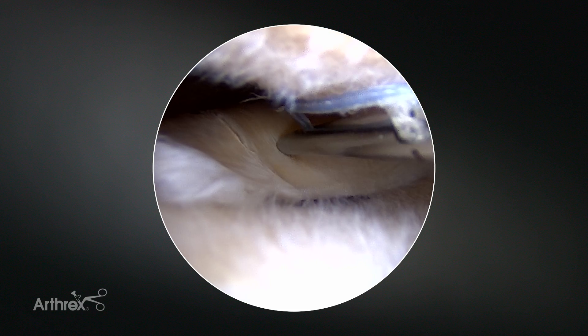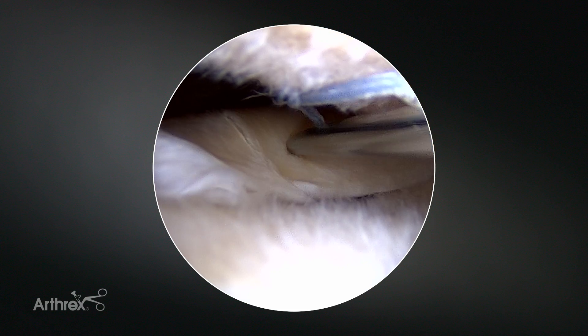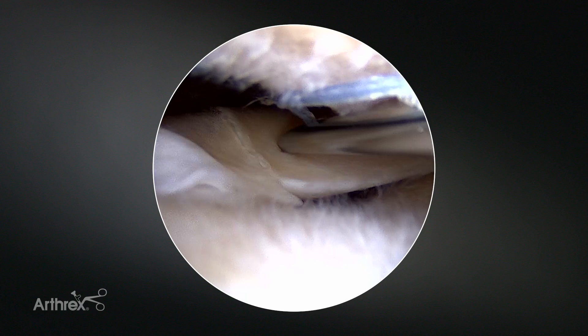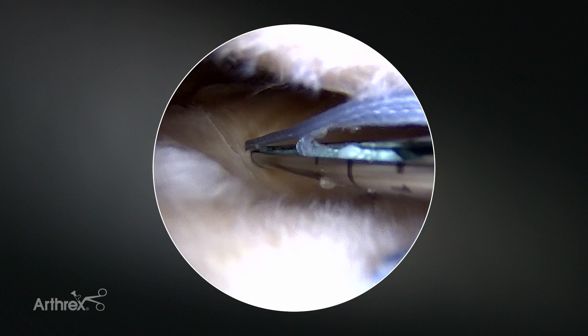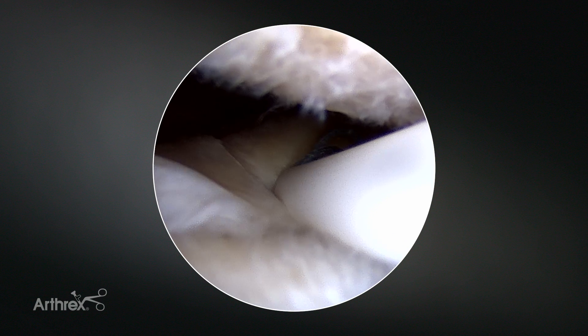And with this sharp tip on it, I can now reduce and move the meniscus where I want it to be. I can go left, go right to push it one direction or the other, and then we'll just implant it into the capsule.